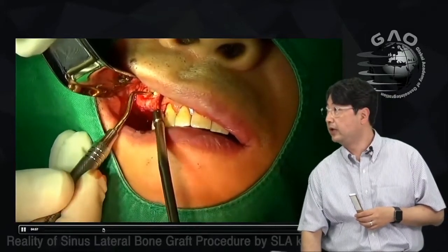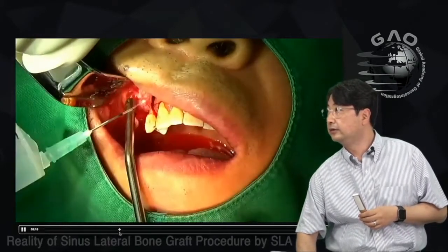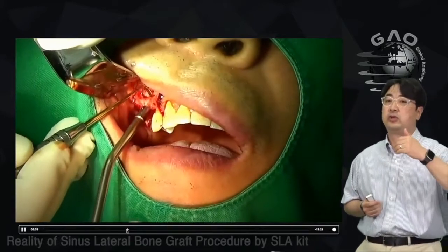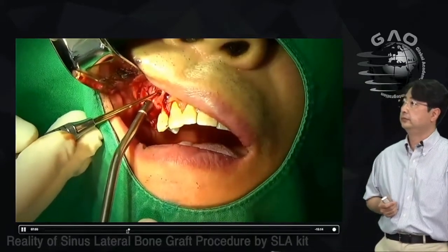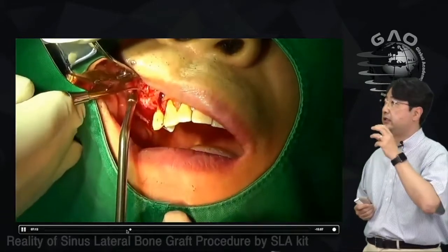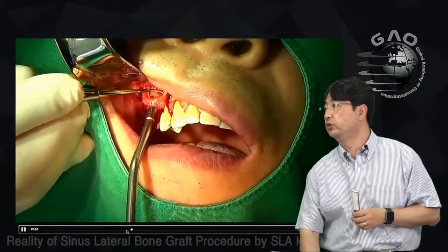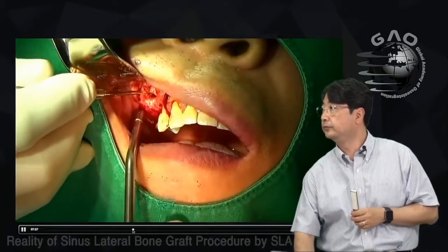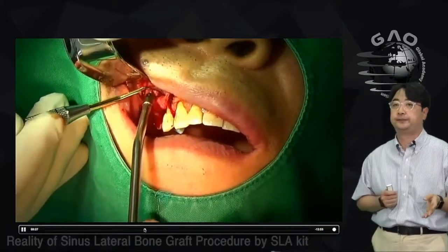I start a little above the window with number one freer elevator for mesial and distal dissection. Then number two to go down from the window to the crestal part. Using push-out motion — not pulling down — with the tip touching the bone wall. Then the wider part of number two, and number three to go further distal and deeper.